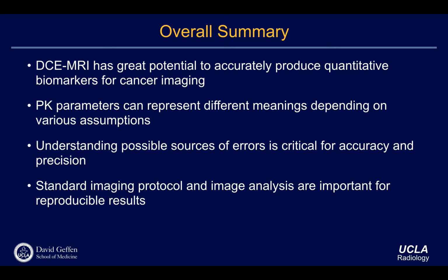Again, that's within the same vendor. UCLA has a lot of Siemens scanners, and within the same vendor there's heterogeneity. But if you include a multi-vendor situation, it's a disaster, right? People are working on it, they understand the issues, and they try to change things. But it's not going to happen within a year, because the machines are very expensive and it will take a lot of time to change machines and techniques. So it is ongoing, but what I want to say is that reproducibility is important, and people are paying more and more attention.